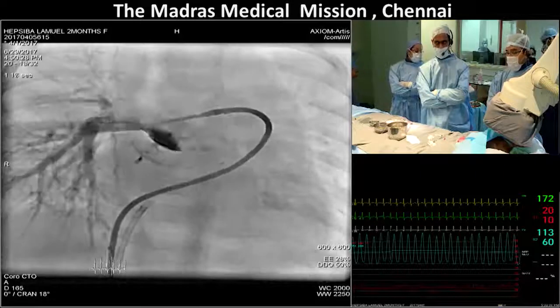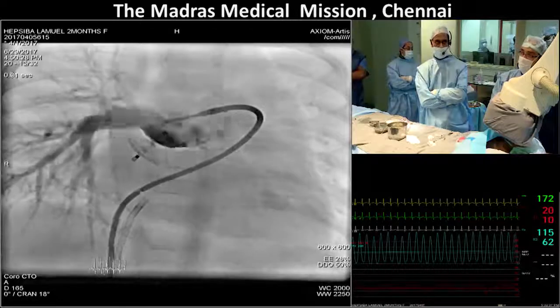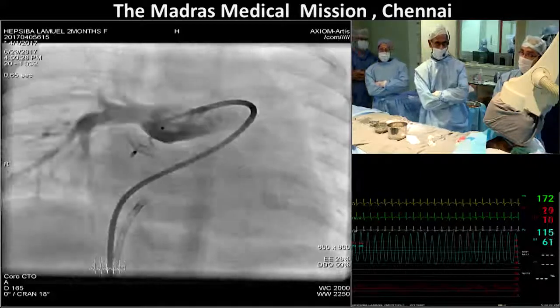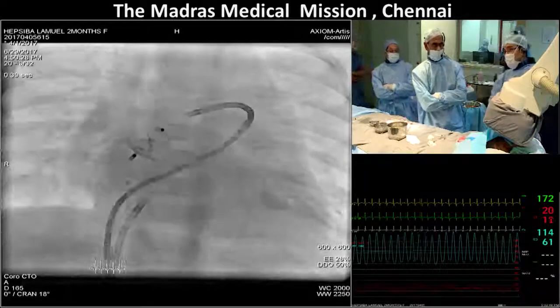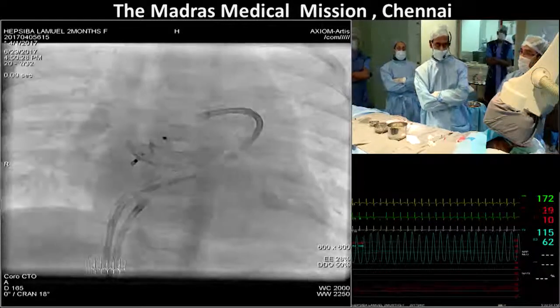Well, you've got more hardware in the left atrial side than you have in the pulmonary artery, right? Yes. And given that, I would agree completely that this child is at some risk from embolic events from the left side of this heart. And I think that the risk of relatively aggressive anticoagulation here would be relatively small.